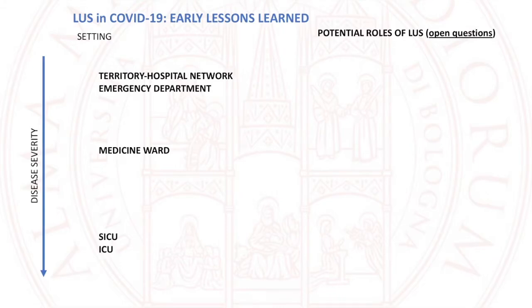Now, very quickly about the potential roles of lung ultrasound. We believe it to be an invaluable tool in the hands of the physician who has the care of the patients. How to use it, though, depends also on the setting that we are using it in. For example, if we are in the emergency department, we want to use it for screening and diagnostic purposes.